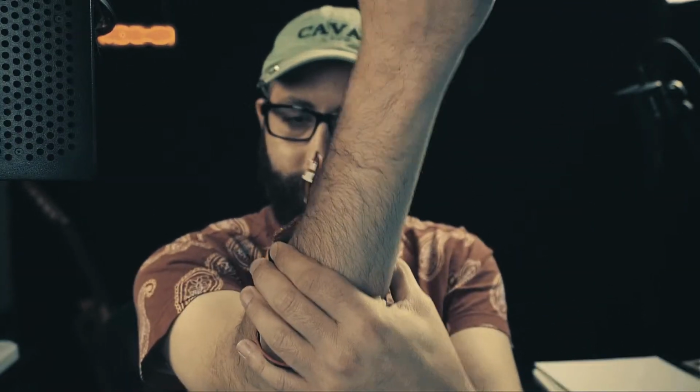So there we go. So I only have one turned on right now, but it is turned on. So I'm going to jiggle it. This is a technical term, jiggle. And try to read the data. And I'm going to stop it while it's jiggled to see if I get any gyroscopic data, because I want to make sure that I have the data set up correctly. So we will run this.